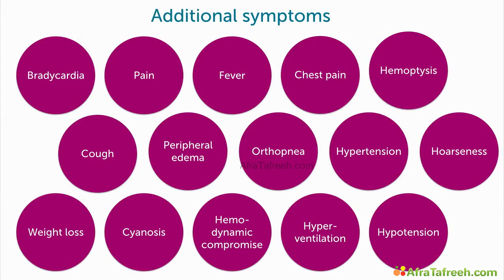The same also holds true for the history of the patient and the symptoms. So some of the symptoms which are related to heart failure and to problems of the lung are also outlined right here.